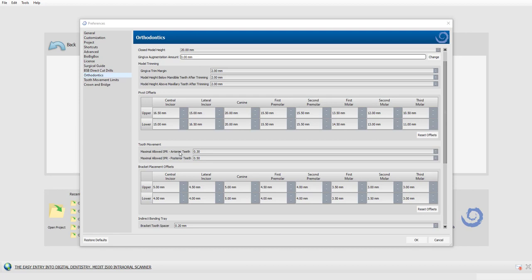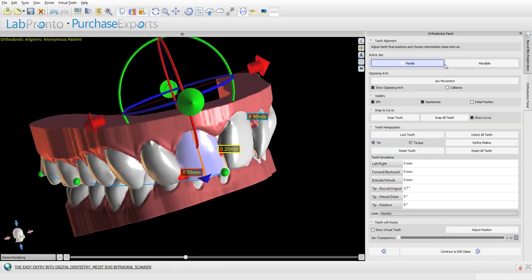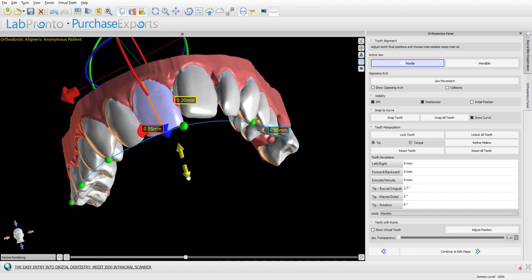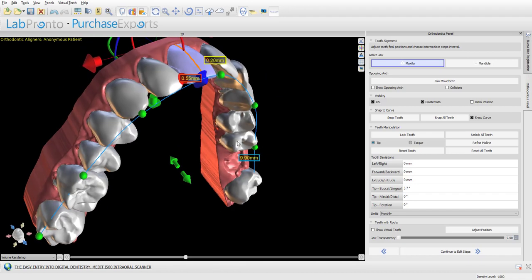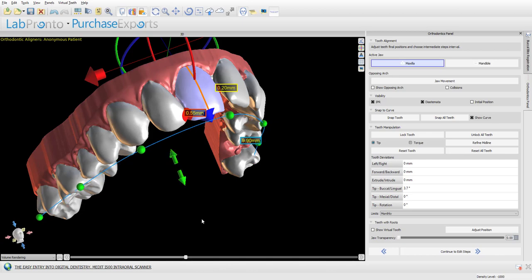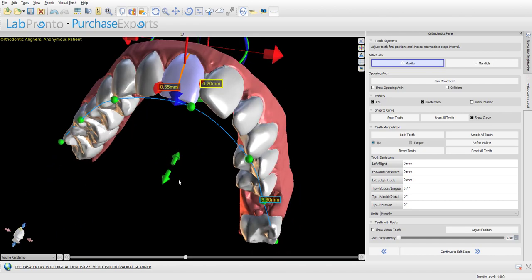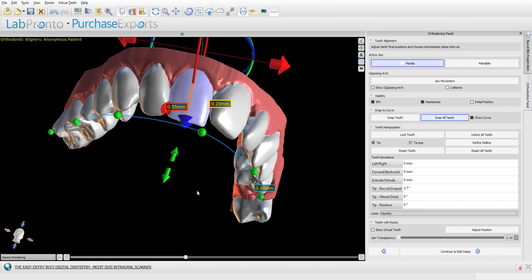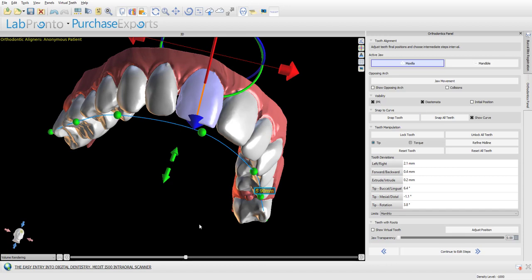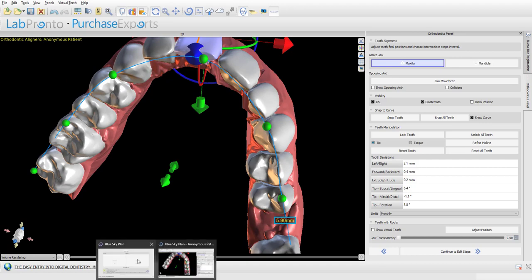The next setting is maximum allowed IPR — with different settings for anterior and posterior teeth. When you use the snap-to-curve functionality to create an automatic digital tooth setup, this setting defines what is an acceptable amount of IPR. You can move the snap-to-curve higher or lower or grab the green nodes to fine-tune it. When you click 'snap all teeth,' the software will reposition the teeth according to the snap-to-curve and the maximum allowed IPR defined in options.